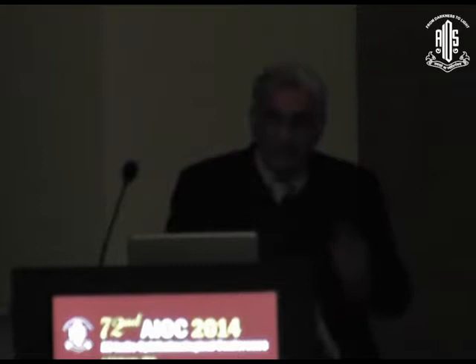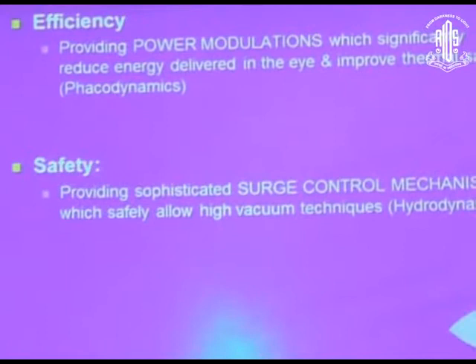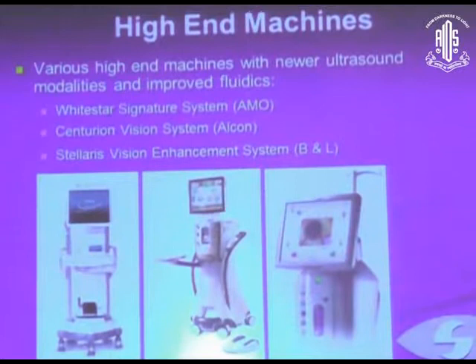We know that power modulation significantly reduces energy delivered and improves thermal safety. We also know that sophisticated surge control mechanisms, which safely allow high vacuum techniques, are nowadays used in more and more high-end machines. And therefore, we will be discussing the three high-end machines: the White Star Signature, the Centurion Vision System, and the Stellaris.